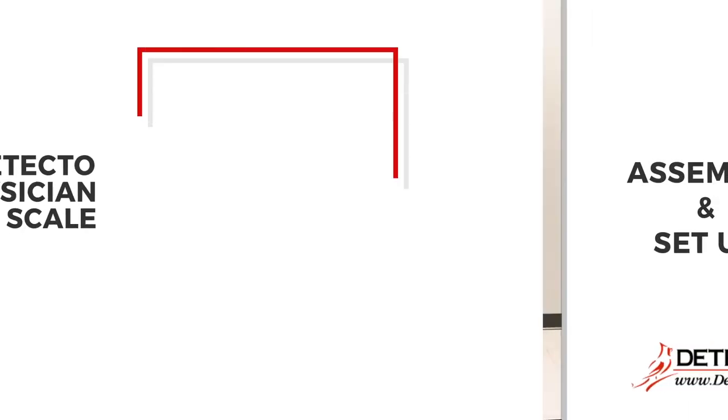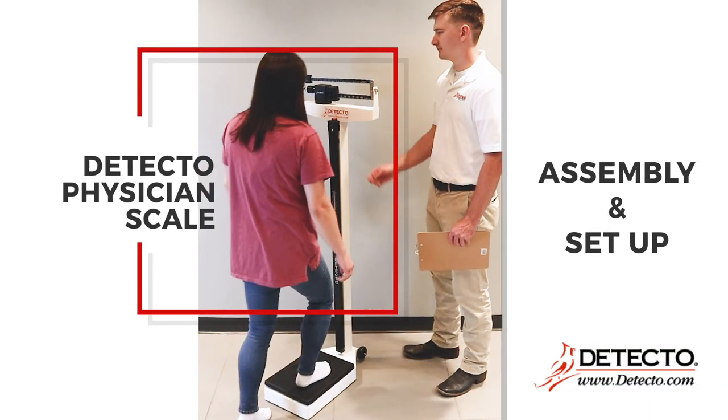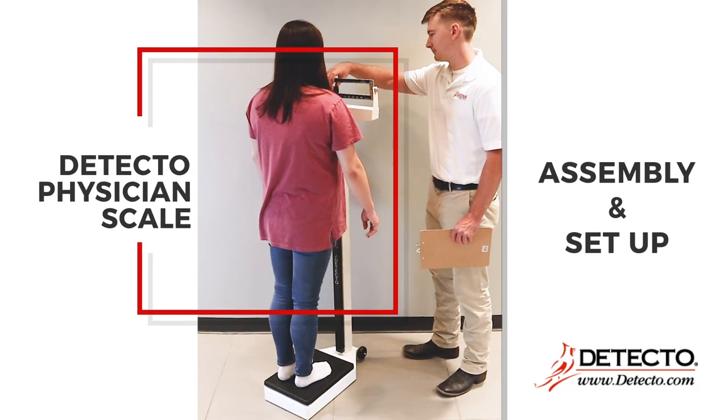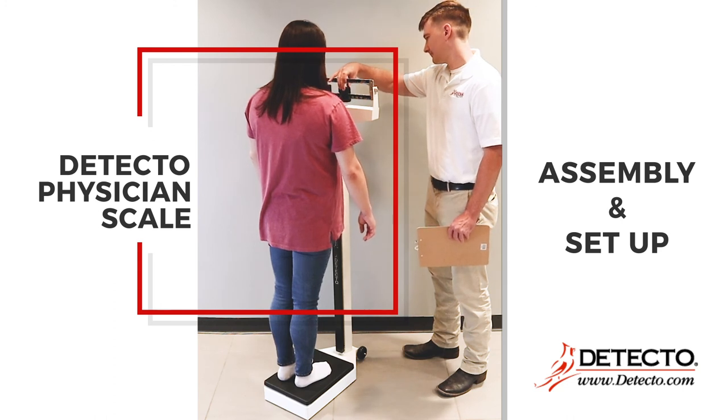Now your new Detecto scale is ready to use. Detecto, it's the name that means scales in the healthcare industry.